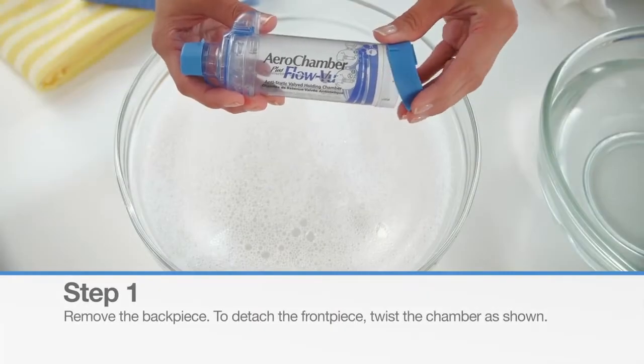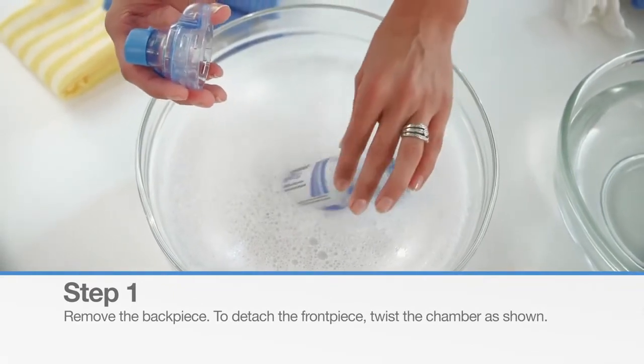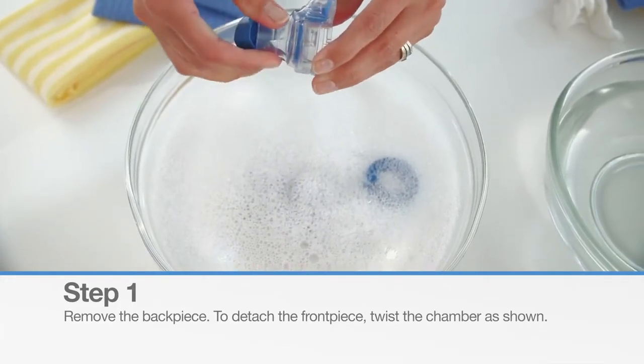Before cleaning, remove the back piece and detach the front piece by twisting the chamber as shown. If you are cleaning the mouthpiece version, remove the tethered mouthpiece cap.